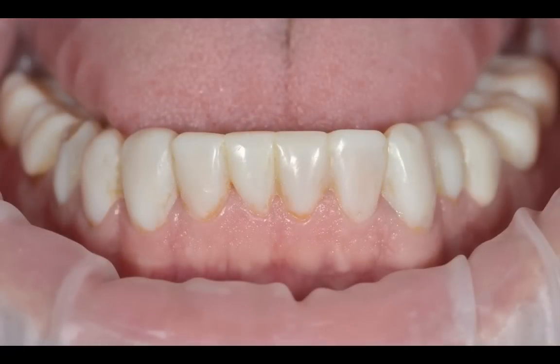And then here are the provisionals. These are the provisionals after three months in the mouth — veneer provisionals with molar crown provisionals and one bicuspid crown provisional. Those have been in the mouth about three months. We have great gingival health.